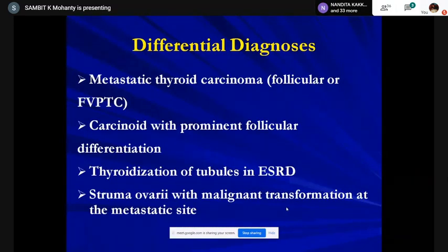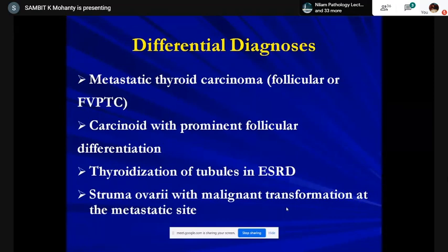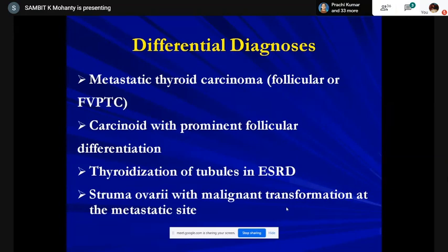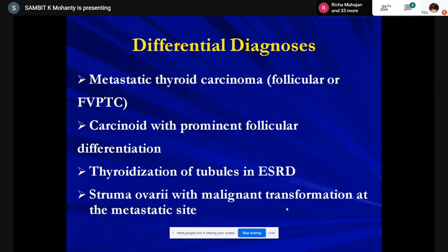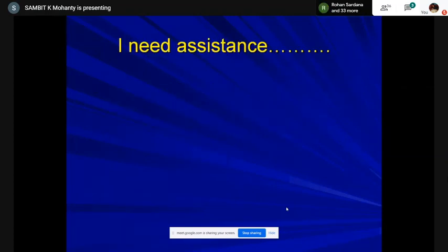We thought probably this was something coming from the thyroid — a follicular or follicular variant of thyroid carcinoma, because of the groups and inclusions, or a carcinoid with prominent follicular differentiation, or a struma ovarii with malignant transformation at a metastatic site. However, pelvic ultrasound, physical examination, PET-CT, thyroid scan, and examination of other systems were all within normal limits.